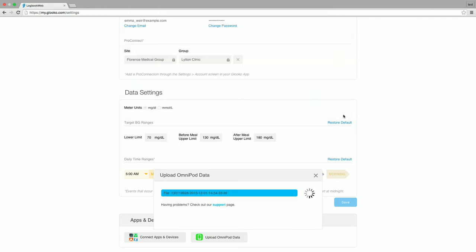You'll see a progress bar begin to fill up as the IBF file is populating your Gluco account. You will know the upload is complete when you see a green and white checkbox and the file name will populate inside of the progress bar in gray.